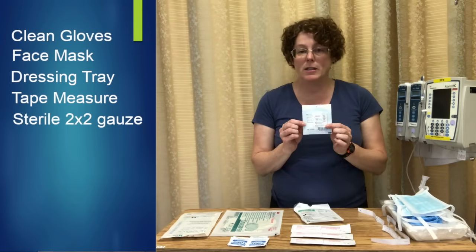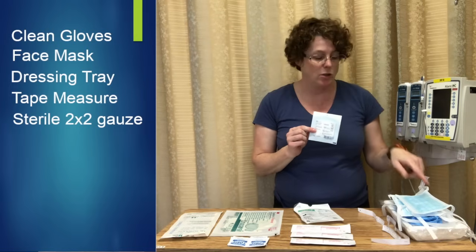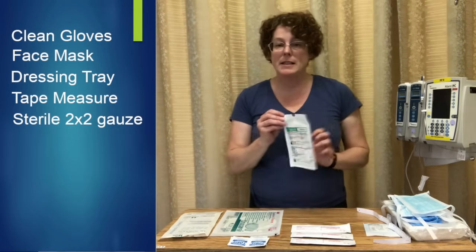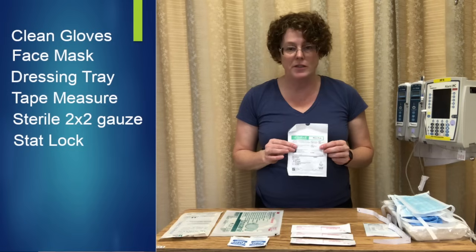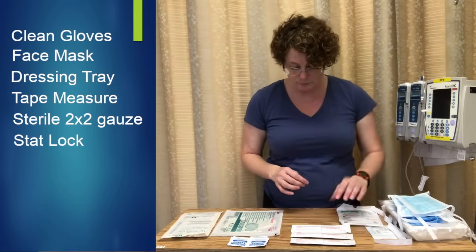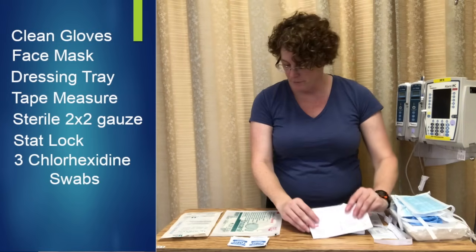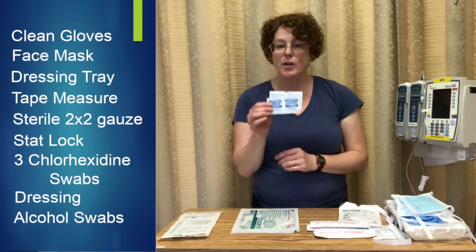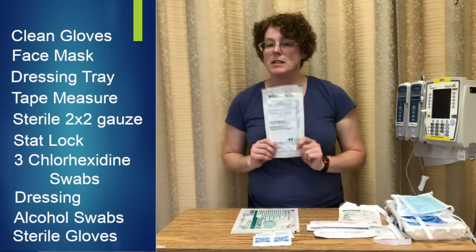I have a sterile two-by-two so that I can hold my line — if I choose not to use my dressing tray, I still need to grab a sterile two-by-two. My STAT lock, which is what this PICC line comes with. You may also find in your facility they have secure caps; those do not get removed, they stay there. Three chlorhexidine swabs, my advanced Tegaderm, alcohol swabs to remove the current STAT lock, and of course my sterile gloves.